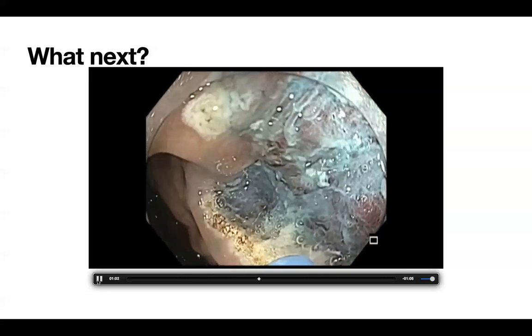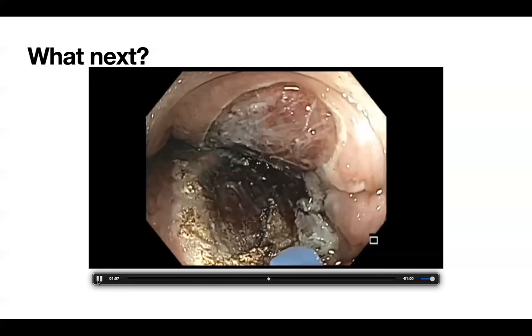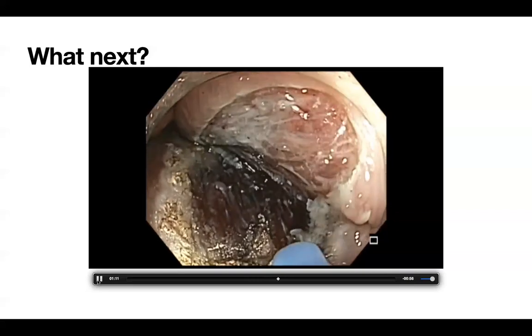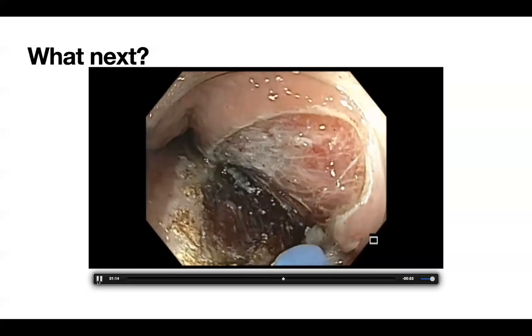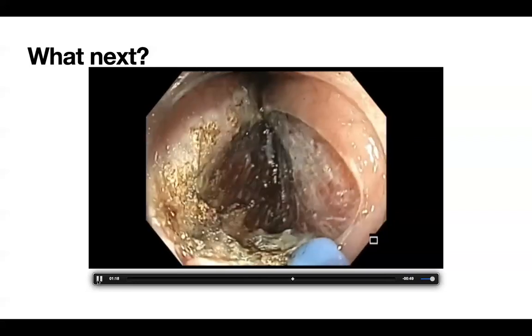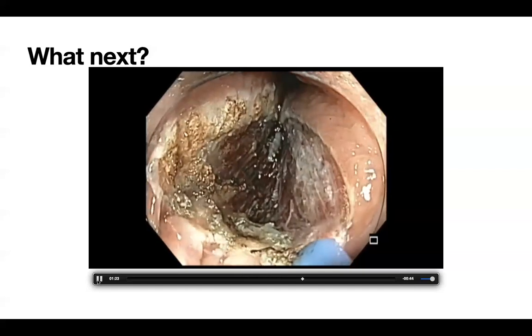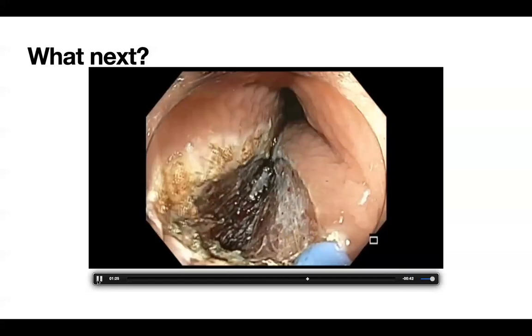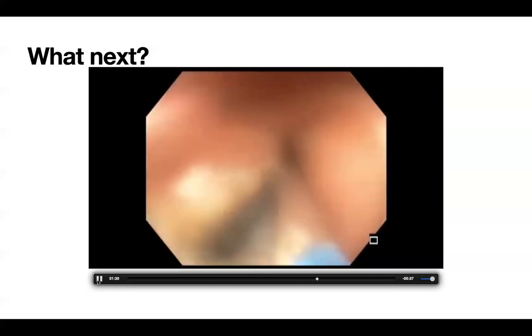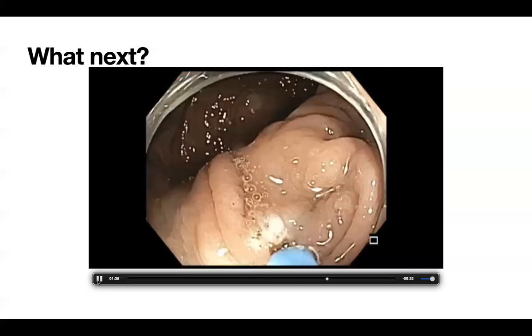So like anything else, we try to follow a protocol. Basically, I've done what I normally do all the time, almost like religion. So we decided to do the APC of the edges. I do hear Sriram's point that we got a little bit outside the margin. So is there a need? But I just decided to follow what I normally do. Sriram has a point. So we decided to do the APC. We completed the APC.